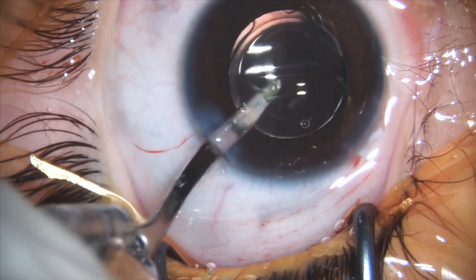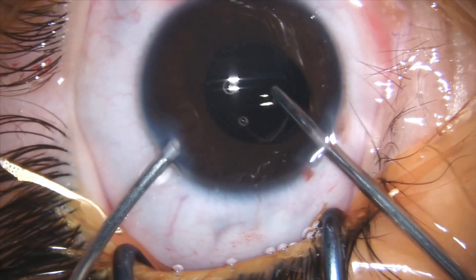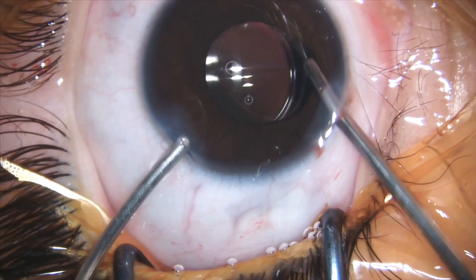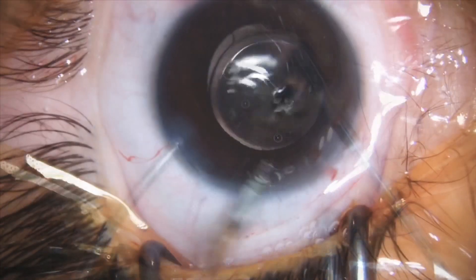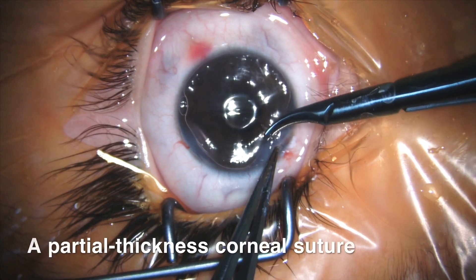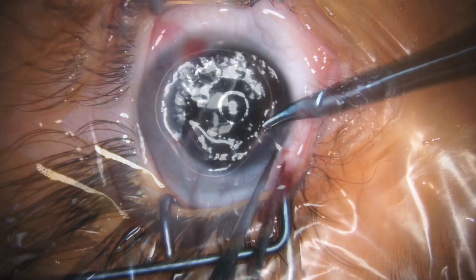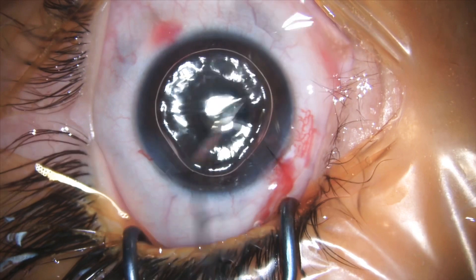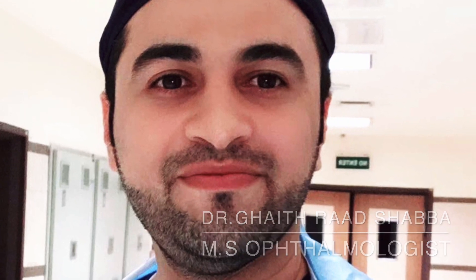The OVD both in front and behind the lens is then removed.